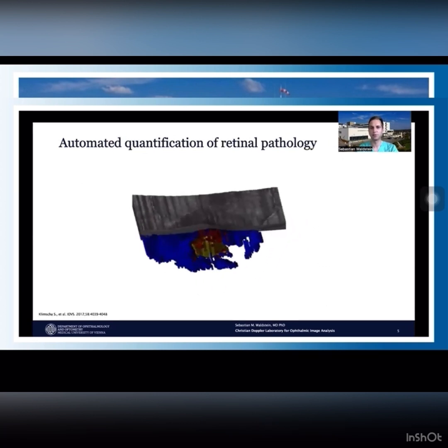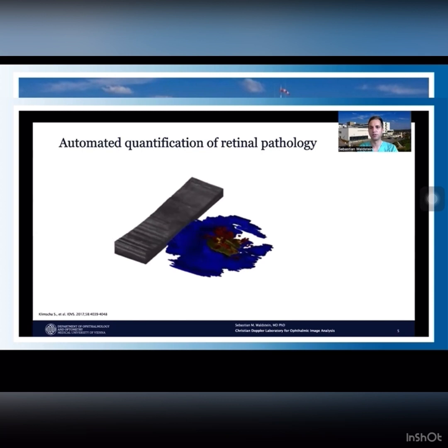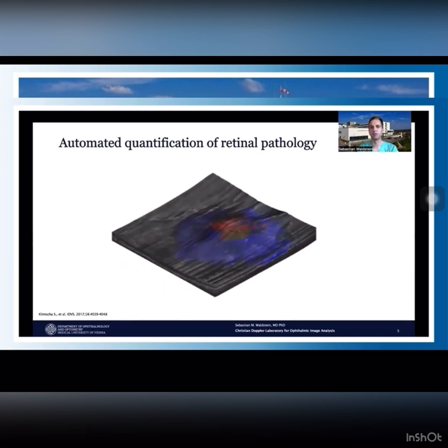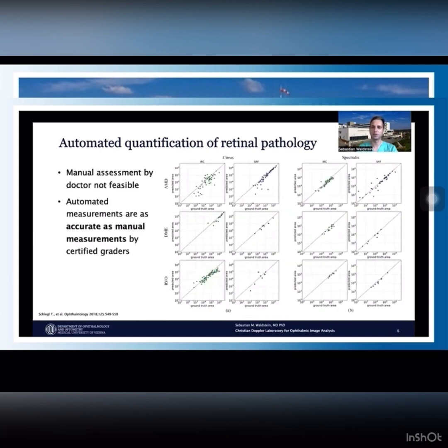We as retina specialists are more interested in really the detail of retinal morphology. And here OCT really gives us a tremendous level of detail that we are currently not really using in our clinical practice, or maybe not quantifying it, because it's just too laborious to manually measure every little fluid pocket. And here AI gives us the opportunity to quantify this fluid very precisely.